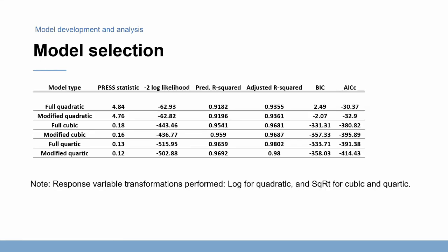So then what I ended up doing is going through the process that is laid out in Design Expert on how to analyze models. I looked at the quadratic, cubic, and quartic models, and I used some of the guidelines that are laid out in the software. And it turns out when I looked at the quadratic model, which fit the data pretty well, it didn't fit the data well at some of the extremes within the data set. And when I moved to the cubic model, that cubic model allowed a better fit in those particular areas. And moving to a quartic model had very little additional effect.